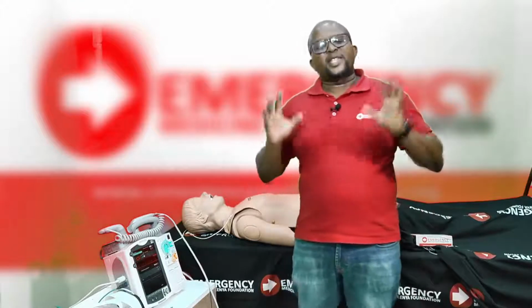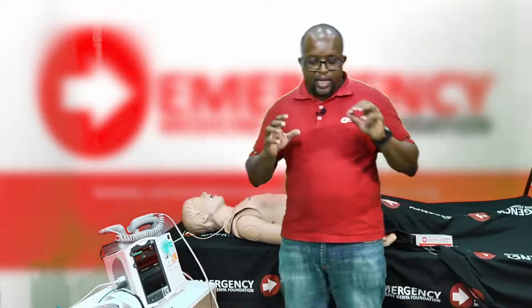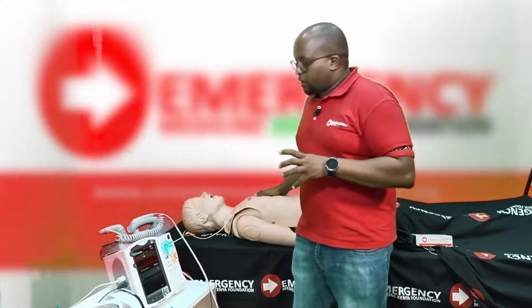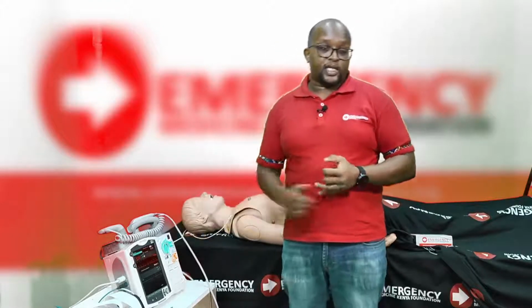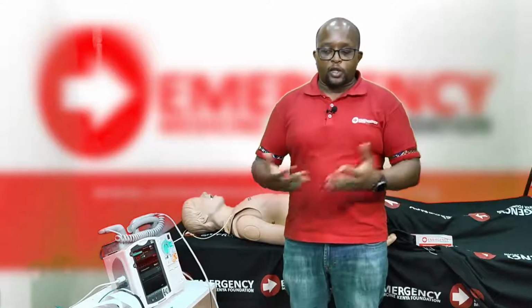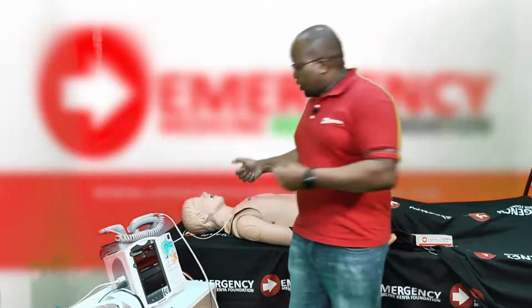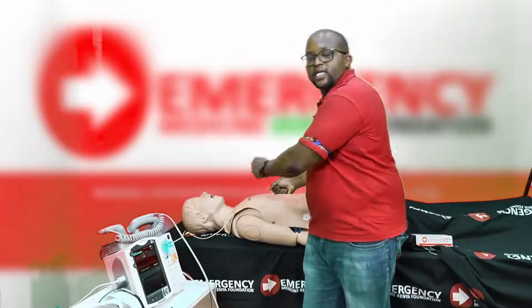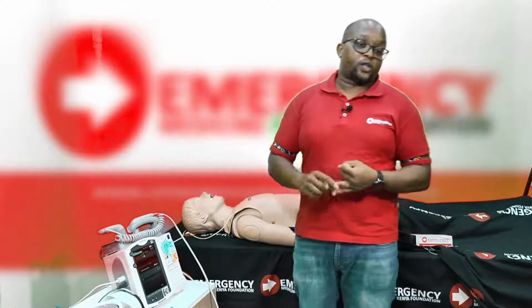Now, what if it still doesn't work after 2 shocks? Okay, which is normal, sometimes it happens. Now, there are a couple of main reasons that may make a cardioversion not work. Okay, the first one, of course, is you're using less energy, so you just need to go up on the energy dosage. So the energy is not optimal to cardiovert the patient. That's number 1. Number 2, your contact on the patient, okay? You're not applying enough pressure on the patient's chest. Your paddles are not having good contact on the patient's chest. So that could be a second reason why it's not working.